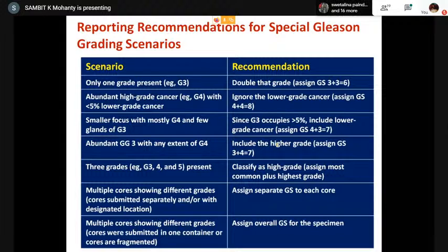A more differentiated thing. And quite often glands are not visible in a prostatic cancer which is metastatic to the lymph node, whereas you do see glands when it's metastatic to the bone. I tried to look for an explanation and did not find one, but a few things they say: when they go to a new place, they are more active transcriptionally. So the chromatin is more remodeled and they look more well differentiated. Instead of being clumpy, they look more rarefied with a lot of proteins, so the cytoplasm is more. That may be the reason.